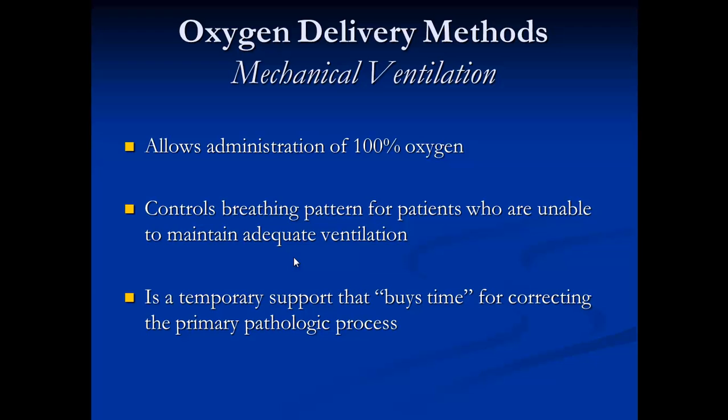Each mechanical ventilation respiratory cycle is divided by inspiration and expiration, as you know. The amount of gas delivered during inspiration is limited by volume, pressure, and flow. Cycling is the changeover from the end of inspiration to the second phase of expiration. It could occur in response to elapsed time, delivered volume, or decrease in flow.